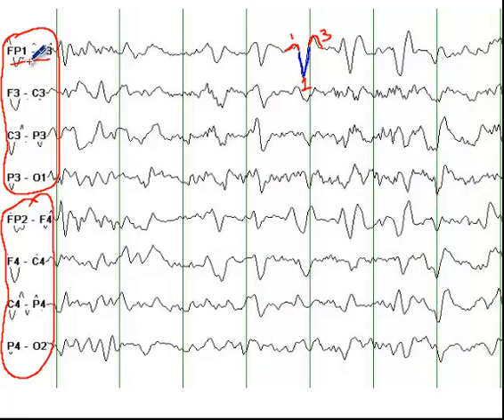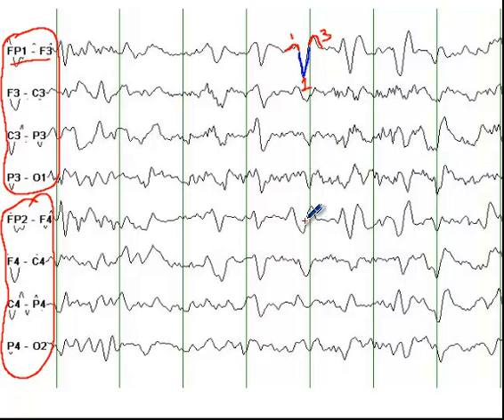You see a number of those triphasic waves here, both in the left hemisphere — FP1, F3 — and in the right hemisphere — FP2 and F4. As you note, the highest amplitudes are in the frontal region, and these extend all the way back to the occipital lobe.